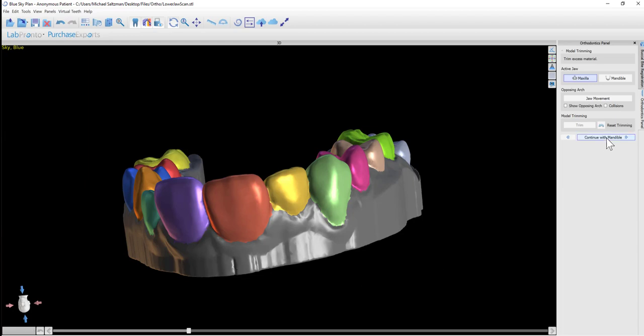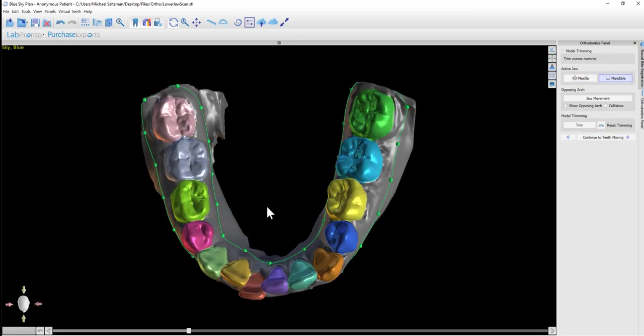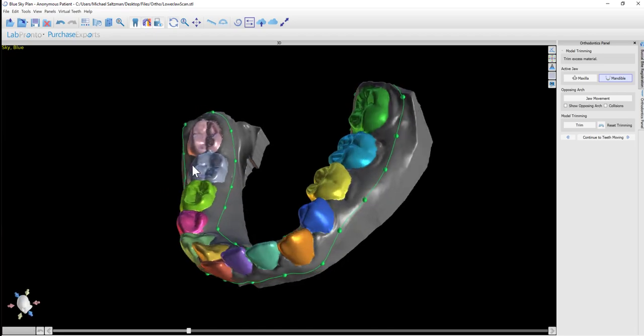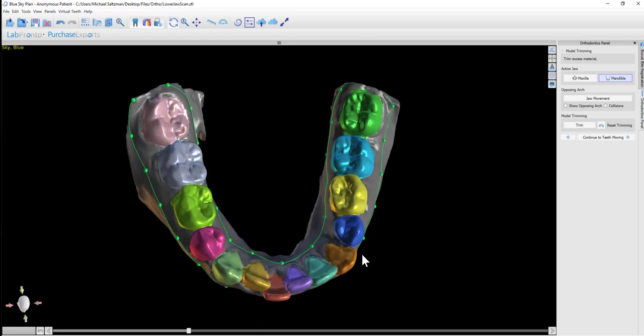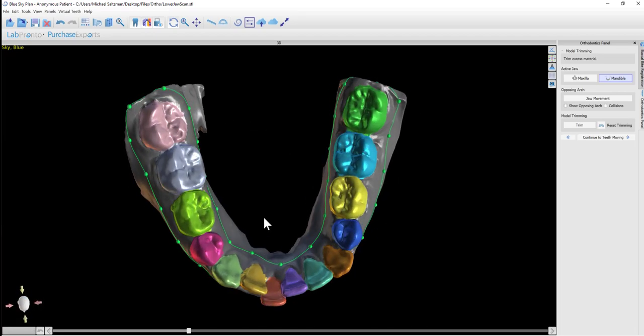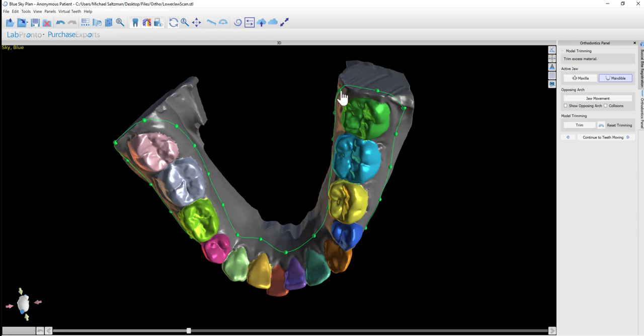Now we're continuing by trimming the mandibular model. I'm going to click Continue with Mandible. The curve shows up automatically for the mandible. We can look it over and see if there's anything we want to change. There's no reason to be concerned if the curve extends past the back of the model.